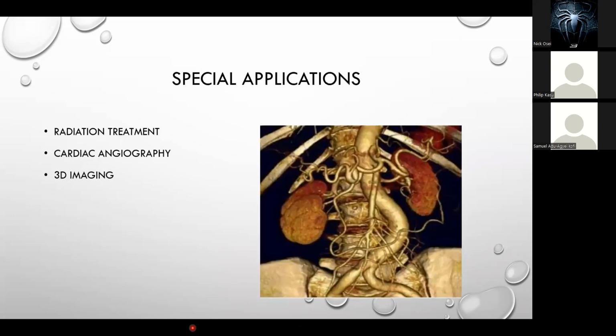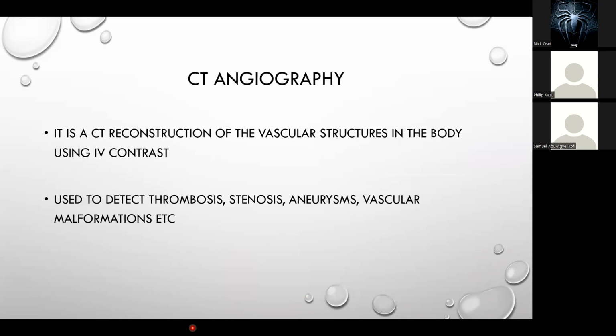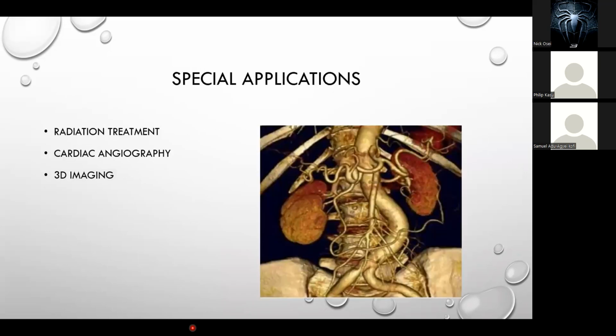All right, so let's look at some of the special applications of CT scan. One of the things we can use CT scans for is 3D reconstruction.